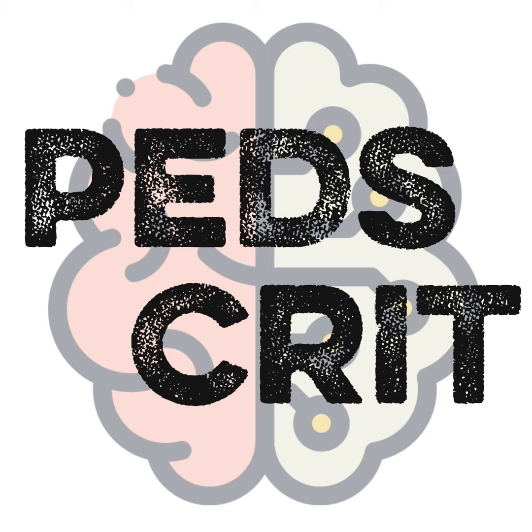And then, sorry, I forgot one last thing, the congenital heart disease population, where it's a completely different world in the cardiac ICU, where after congenital cardiac surgery, the indications would be inability to separate from the bypass for whatever reason, or a low cardiac output state after the cardiac surgery. And then sometimes, very few and far in between, preoperative stabilization, really recalcitrant arrhythmias, even without congenital heart disease. In my little career, I have placed 2 kids on VA-ECMO for very recalcitrant arrhythmias with significant poor perfusion, and then pulmonary hypertension, and last but not least, again, ECPR. Obviously, you always put them on VA-ECMO.